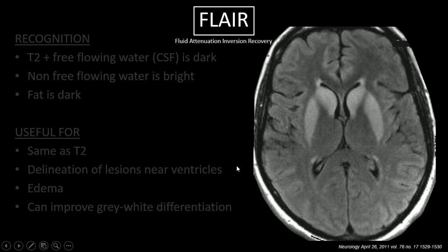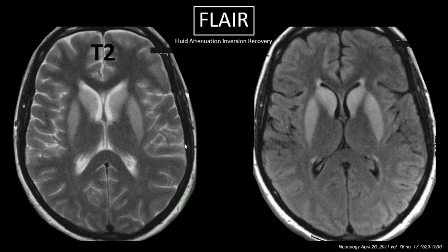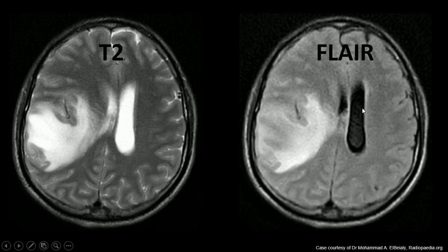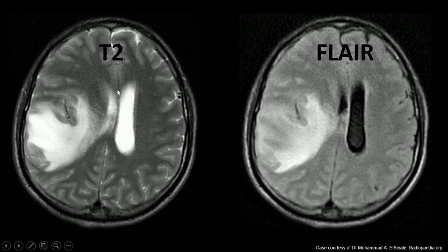Let's compare FLAIR to a T2 image. It looks just like the T2 image, except the ventricles or CSF spaces are inverted. Here's an example of where FLAIR does a better job of delineating lesions near the ventricle. On T2, we've got something causing edema that comes right up against the ventricle, and it's really tough to tell whether the ventricle is completely obliterated by edema. But comparing to FLAIR, we can see nice delineation between the area of edema and the actual ventricle.